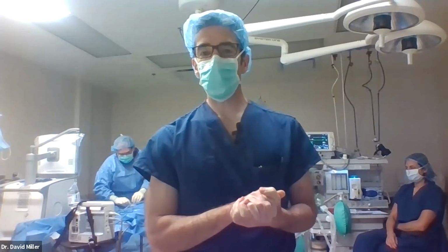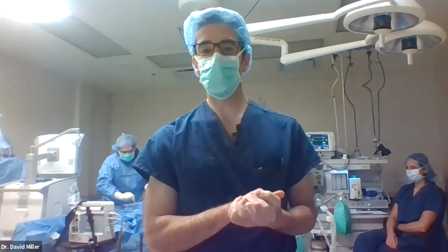When you make a nasal retinotomy, would it cause a temporal field defect? The answer to that is it does. You can map those out. But again, I've never had a patient be symptomatic from it. Almost never, I should say. But I can't think of the last time someone's complained of it, honestly.